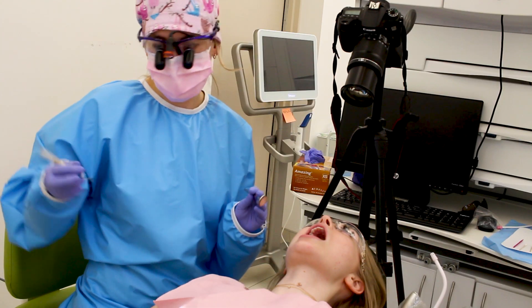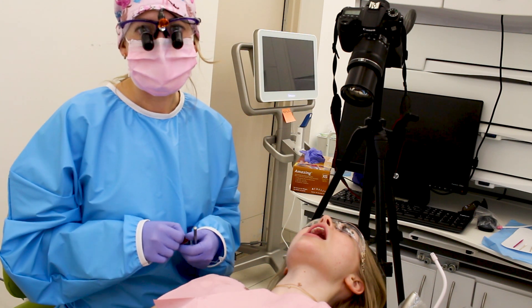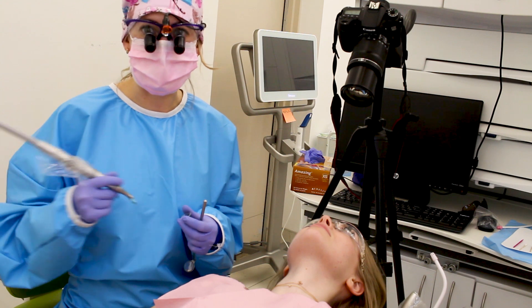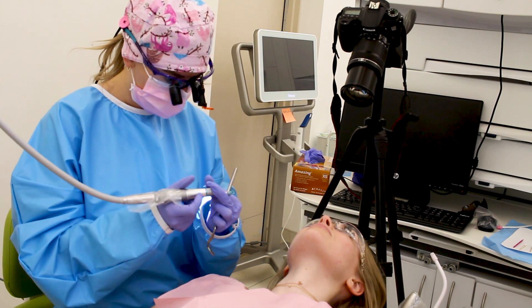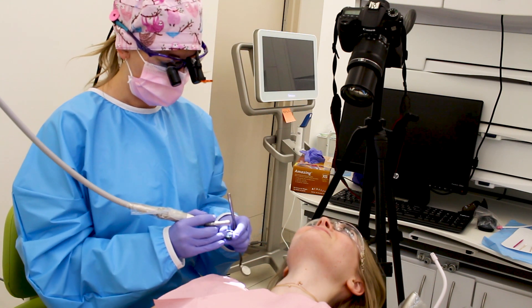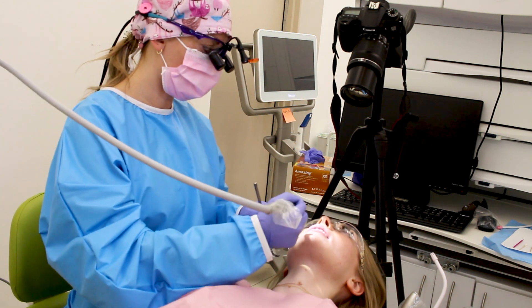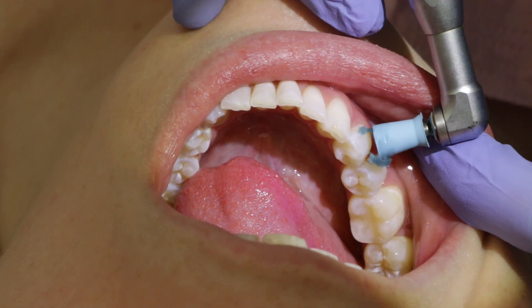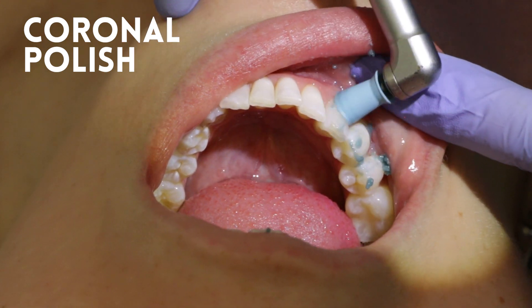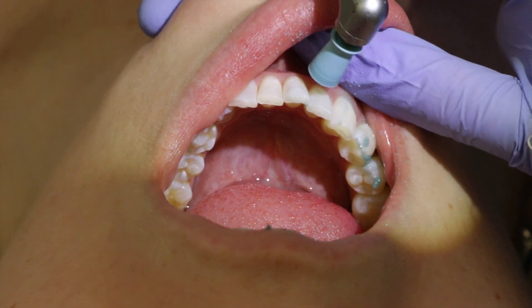Following that, we do the polish. Polish is good for removing stains and it helps to buff the surface texture of the teeth, which makes it less likely for them to catch food, bacteria, and plaque in the future. I have blue raspberry today. We use a polishing piece, and similar to the ultrasonic, you go all the way around the shape of the tooth. We're going to start on the bottom here just to show you — we're just going to buff out any stains or extra surface buildup.